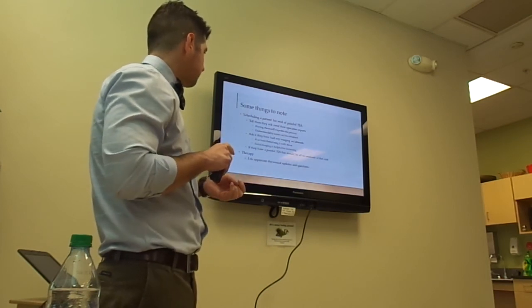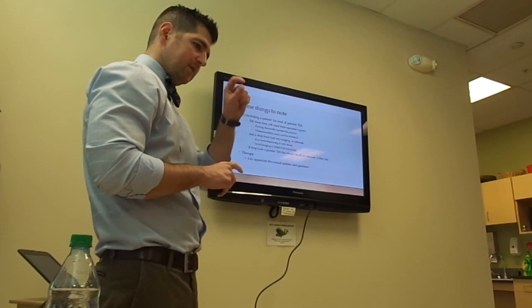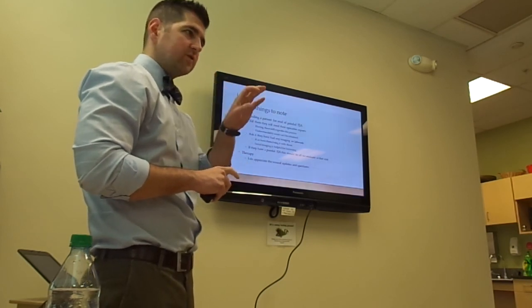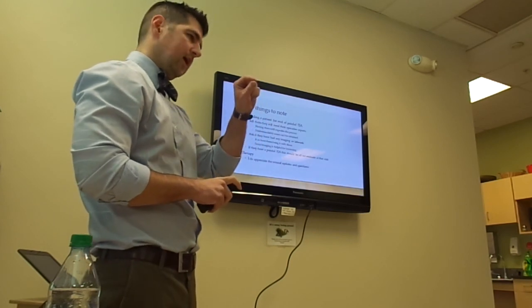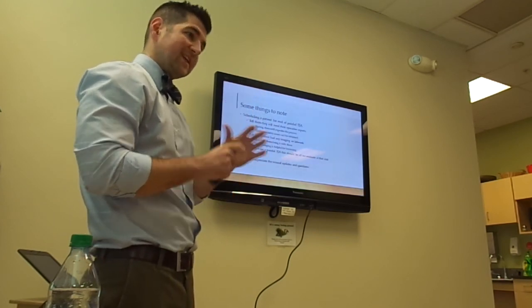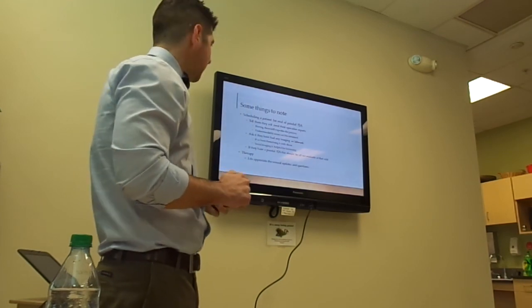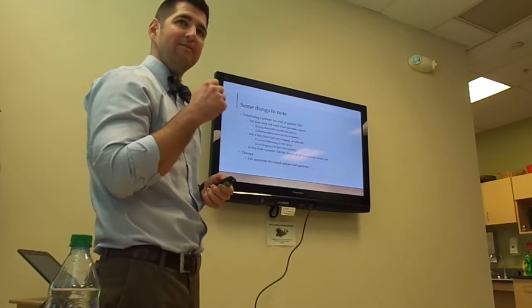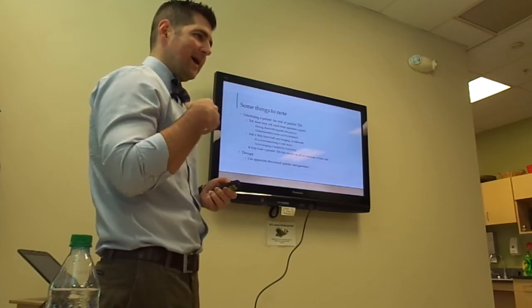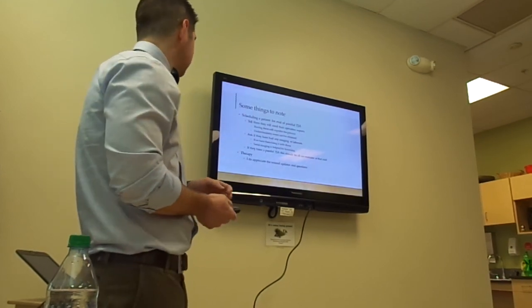If they have images. One of the things about loosening is it can be very subtle over time, and one x-ray isn't always very dependable in telling if it's loosening. But if you see a little black line that's developing and it gets bigger over time, and they have x-rays from an old doctor that they were seeing, that can be very helpful for me in order to make the diagnosis on that visit, as opposed to having them come back 3 months later to take another x-ray to see what it looks like at that time.